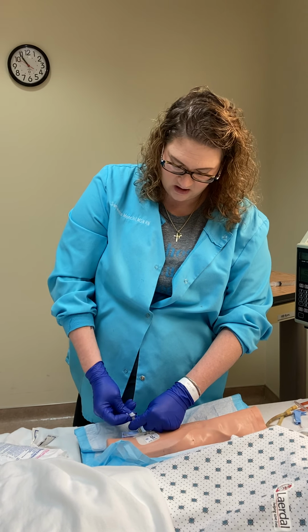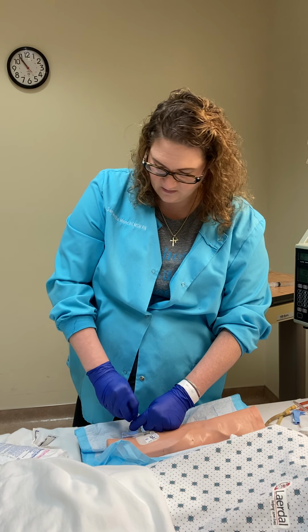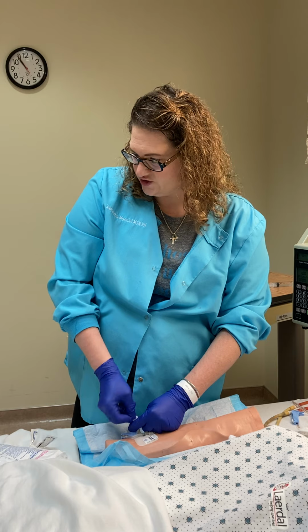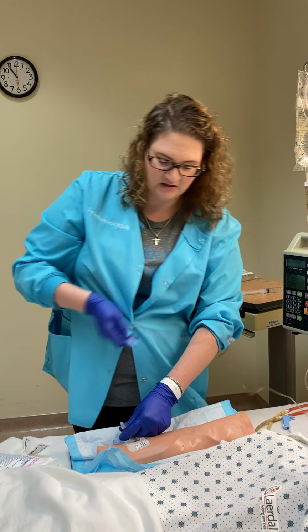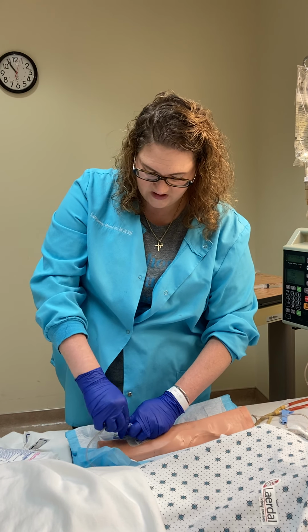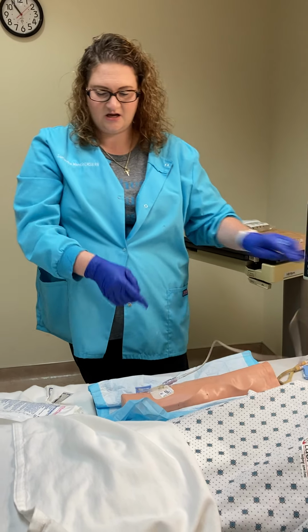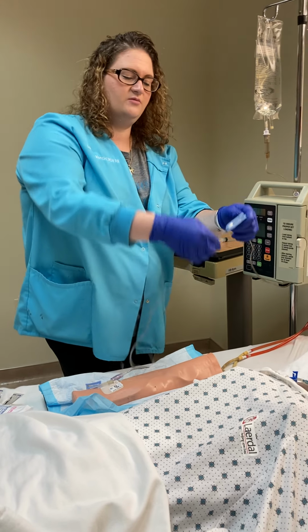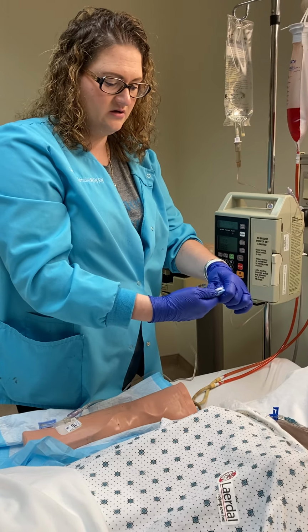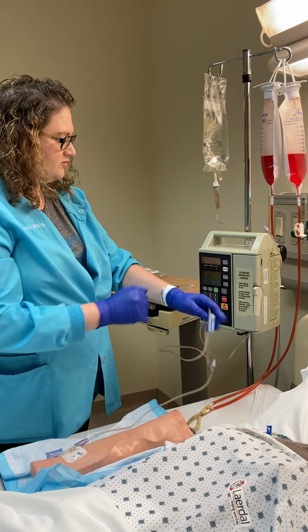If you want to close the clamp in between, you can. With a peripheral and with the negative pressures, you don't necessarily have to right then and there. If you want to, it's additional safety. But typically with the peripherals, just connect, flush, re-scrub, and connect our line. We make sure that the clamp is open. Okay. Both clamps are open here.